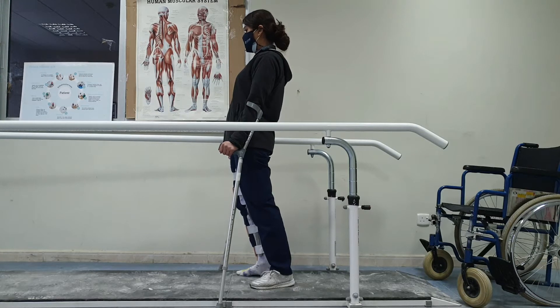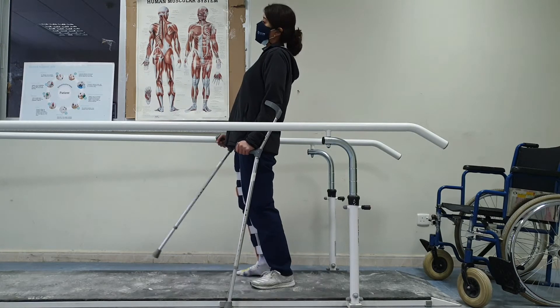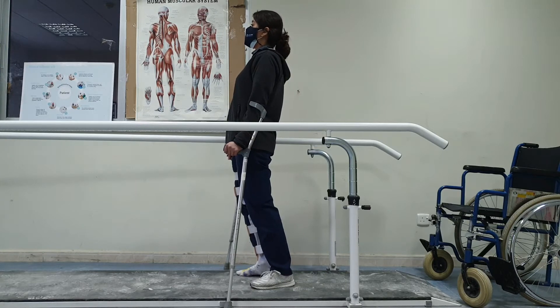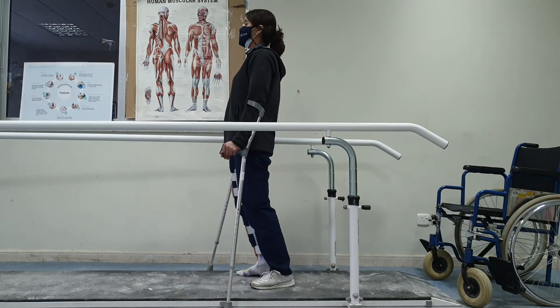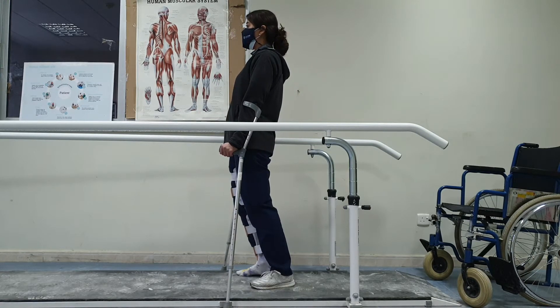We will start with one hand off: raise one crutch off the ground and move it back, then the other crutch. Then try to move both crutches off the ground and move them back. The advantage of being between the parallel bars is that if the patient loses balance, they can grasp the bars at any moment.